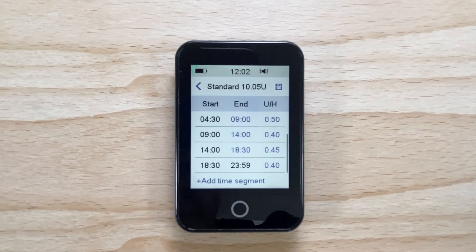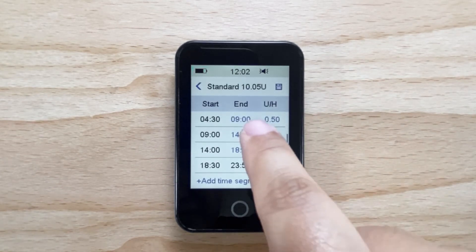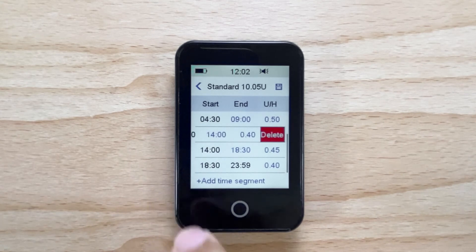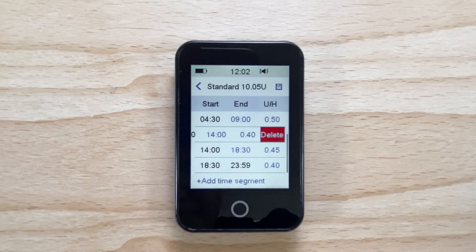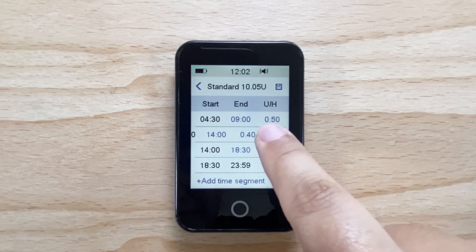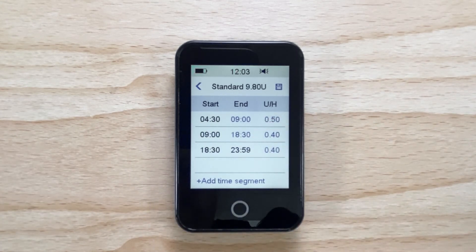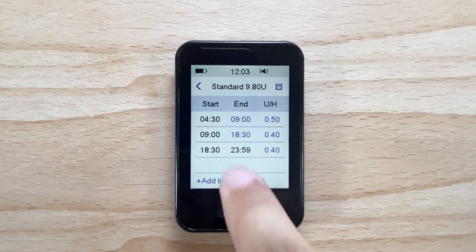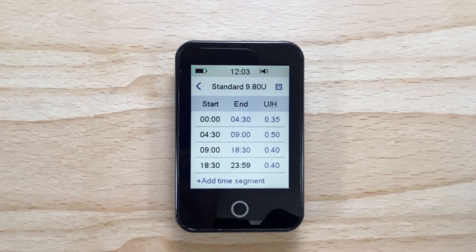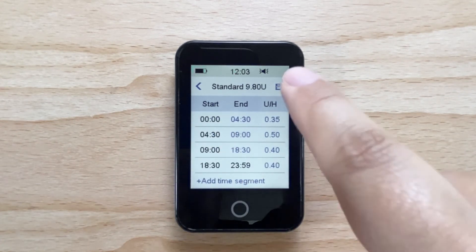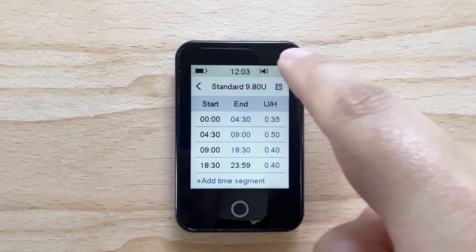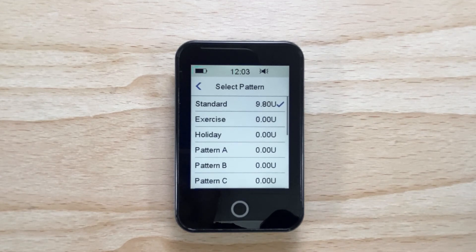If you want to delete a time segment, simply slide your finger across the time segment that you wish to delete from right to left and tap delete. Once you have completed the basal rate setup, tap the save icon in the top right hand corner of the PDM to save your basal rate.